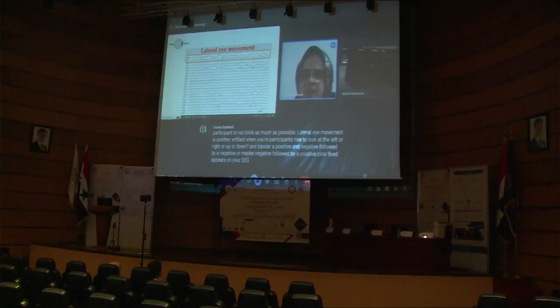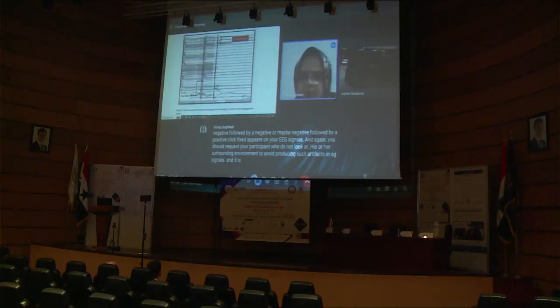Again, you should request your participant not to look at his or her surrounding environment to avoid producing such artifacts in EEG signals. And there is the artifact of a laptop or an electronic system plug-in.